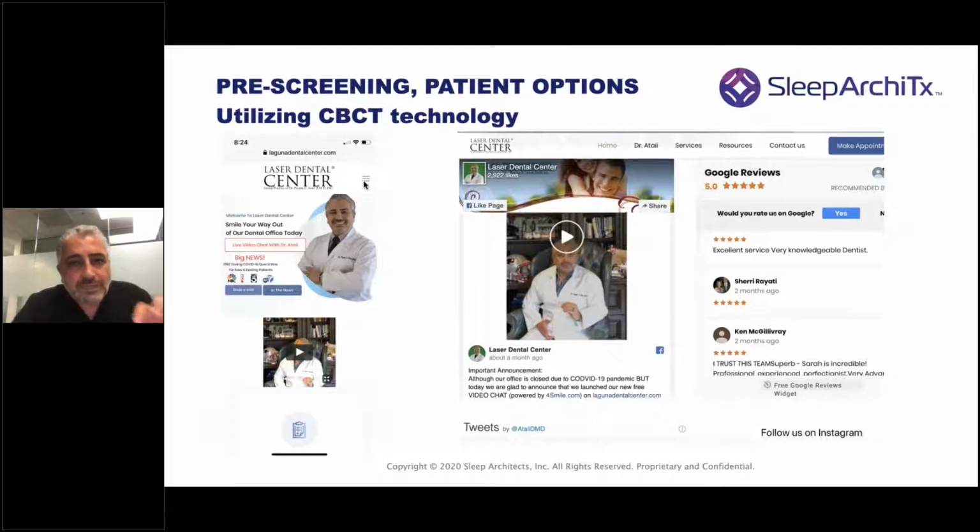It's more important now to talk about CBCT as a part of our treatment planning process. It has to be. It's always been, but we've been worried because, oh, the radiation. I don't want to expose my patients too much. Look, I have an 8-year-old who's got severe issues with asthma. I purchased my CBCT specifically for my 8-year-old. Why? He's 13 now, and guess what? I've been able to manage his airway by being able to see with a short scan.